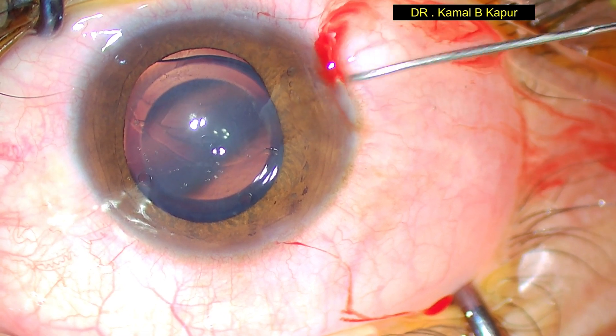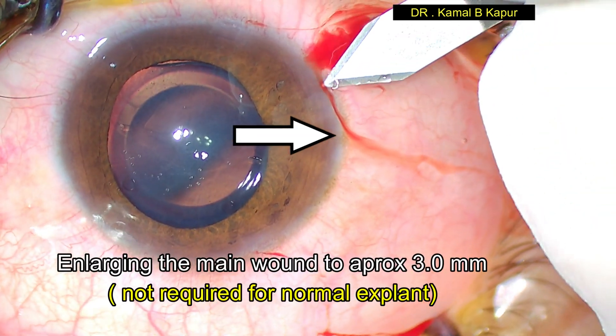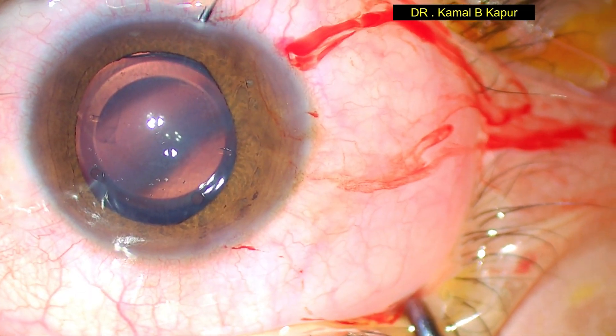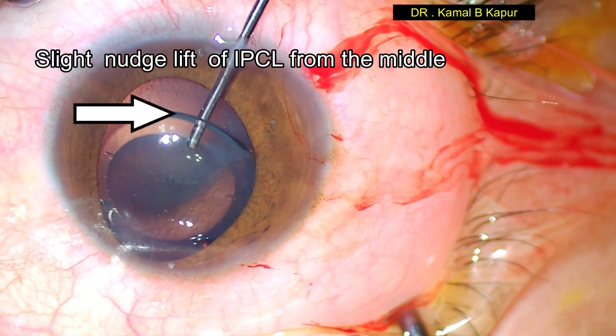As you notice, the peripheral anterior chamber is shallow here — it was stopping the entry of the instrument from the main wound. We proceed to enlarge the main wound to approximately 3 mm. This step would not be required when explanting a normally placed phakic lens.